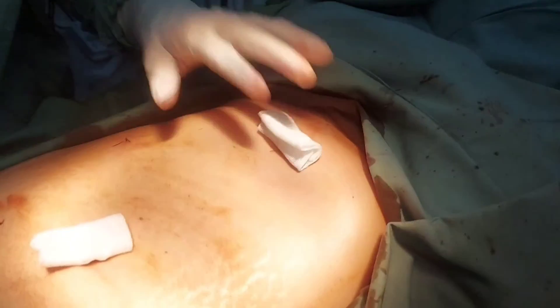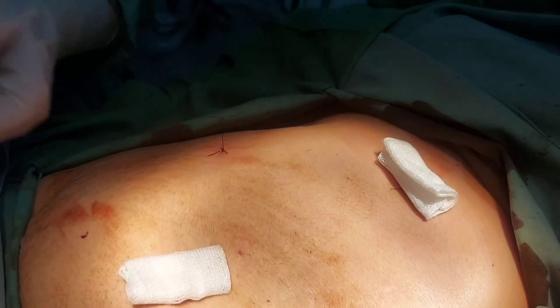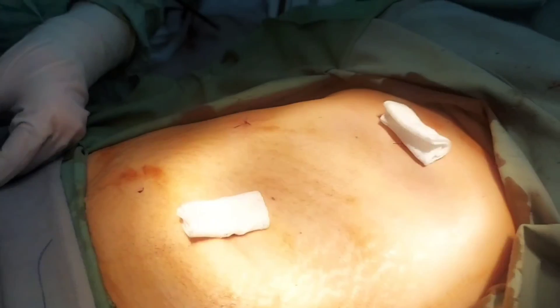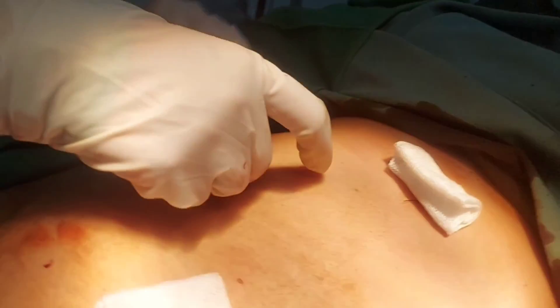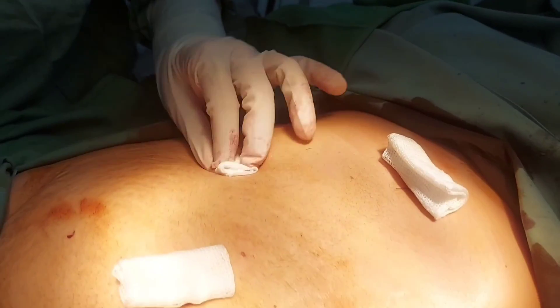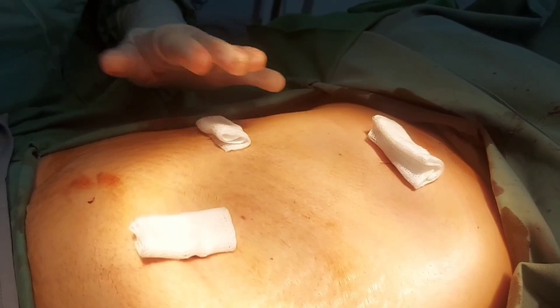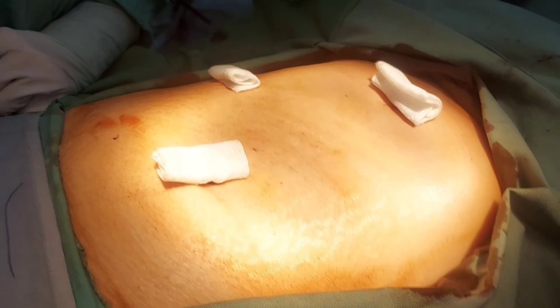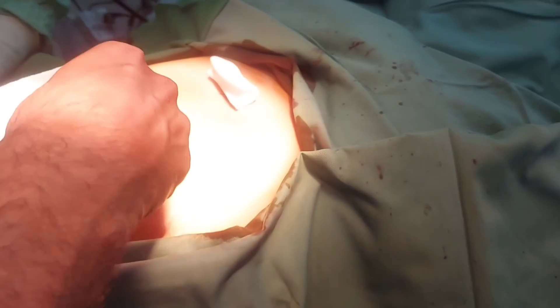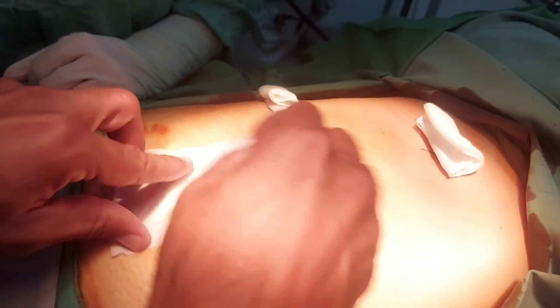With small pieces of surgical gauze, dressing is done over the wound area, and sticking plaster is applied over the sites to end the procedure.